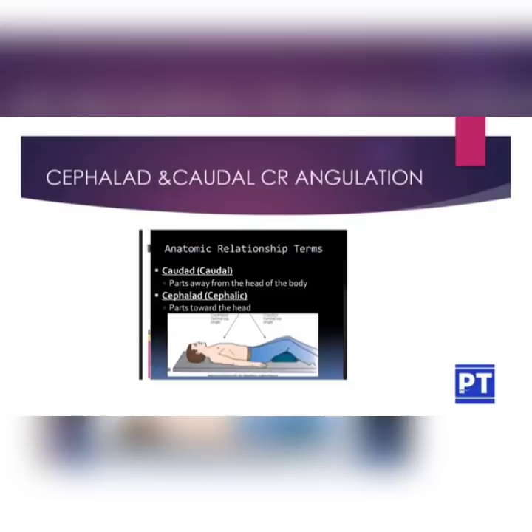This means in the above slides we have studied the position of a patient, how the patient is supine or prone, recumbent, then erect, lateral, decubitus. Many rotations, even oblique, we have studied. So in some cases the patient won't be able to rotate. In such cases we will be rotating the X-ray tube. So if we are rotating the X-ray tube towards the feet, it is known as caudad angulation, and towards the head it is known as cephalad angulation.